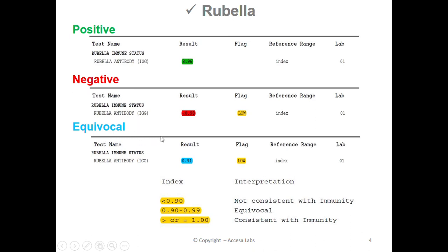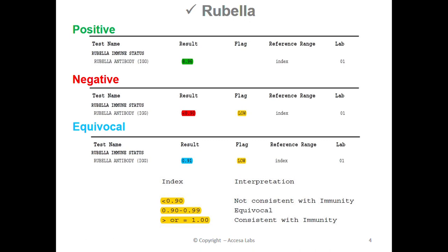Lastly, we'll look at the equivocal result. We'll look under our result header for our numerical value. This report has a result of 0.91. You may also notice a low notation. Based on the Quest Diagnostics Result Index shown here, any result between 0.90 and 0.99 is equivocal, which means the result is neither negative nor positive.